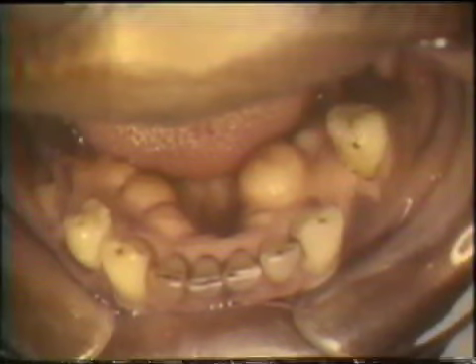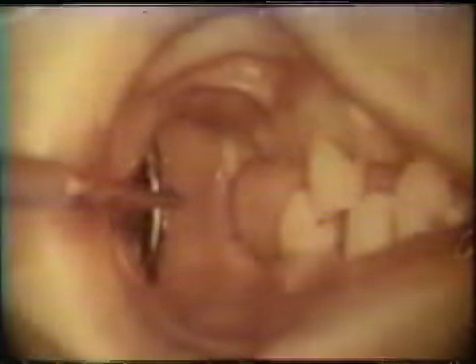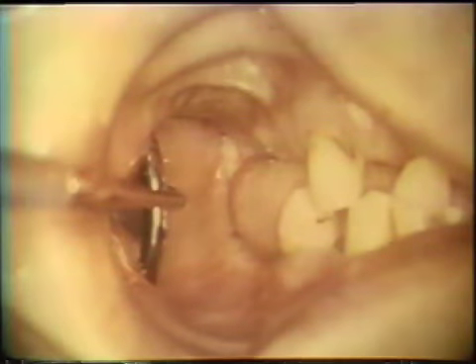Now, the second slide that we're going to show has an area of impingement, again in the tuberosity area and the retromolar pad area.